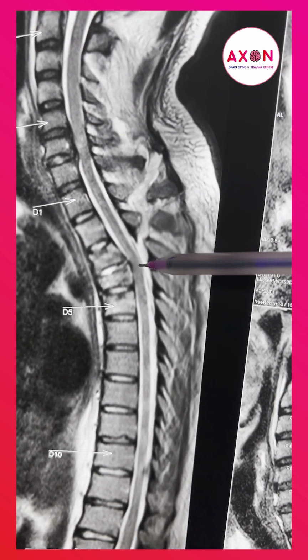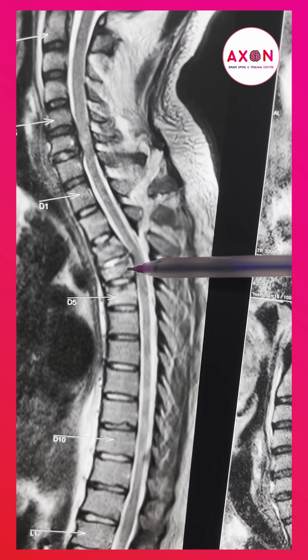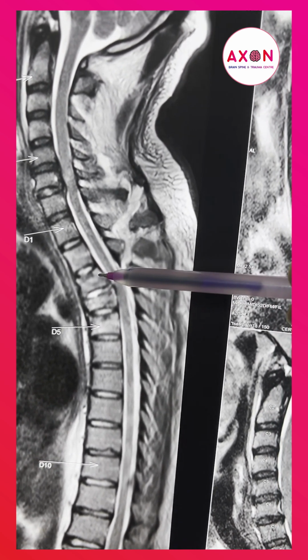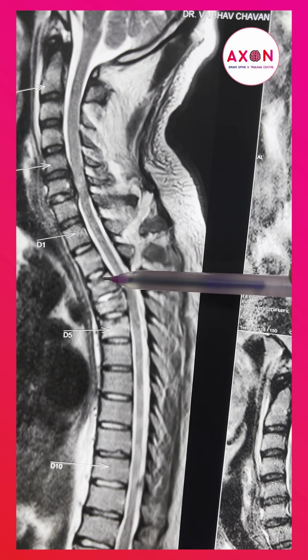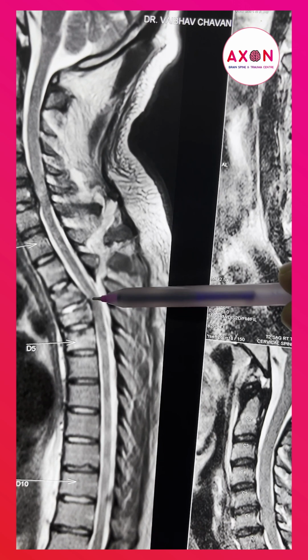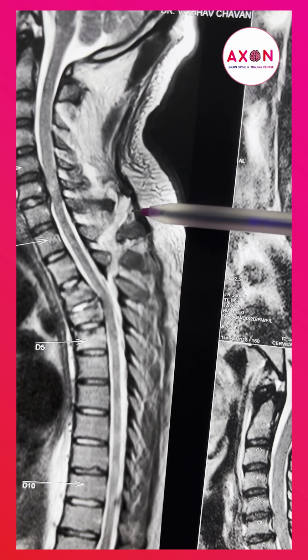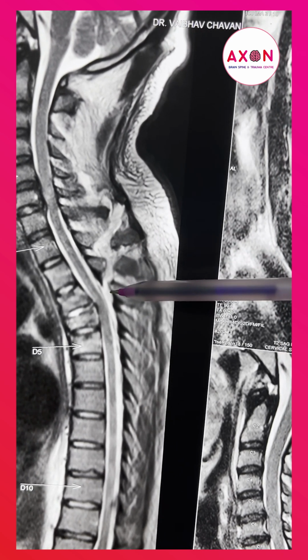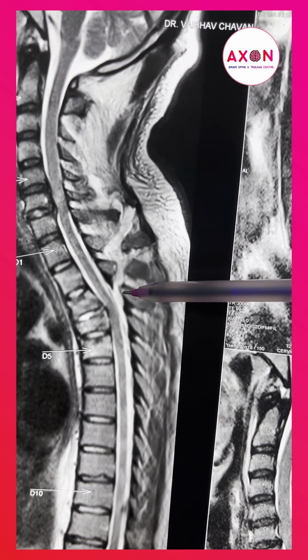Lower down on the thoracic vertebra, you can see this is the D4 vertebra. It's compressed, its height is almost 50% reduced, and the superior part of the D3 vertebra is also fractured. You can see the cord is bent like this, so there is a compressive element. We need to stabilize it. Posteriorly, you can see D1 and D2 spinous processes are fractured, and the D3 spinous process is fractured at the base.